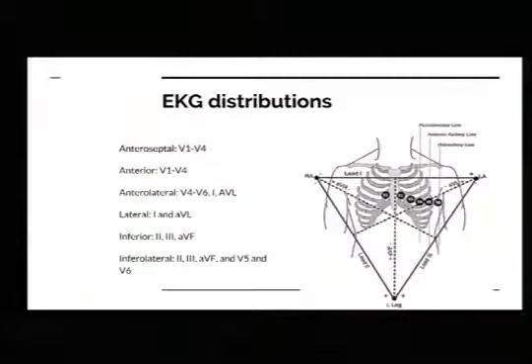So there's your anterior septal, your anterior lateral leads, inferior, and inferior lateral. There's no good way other than when you look at your 12 lead knowing where your distributions are, but these are something you need to know. Where your MIs are, what leads. And I have a nice little color version of this later when we get into the MI.